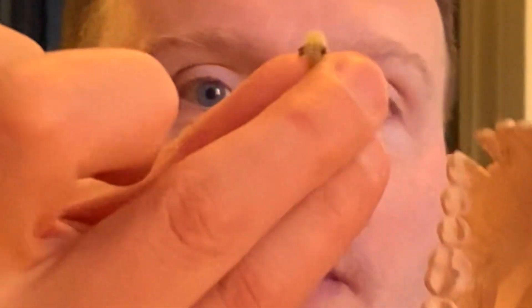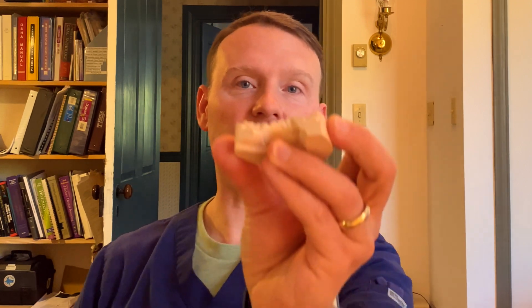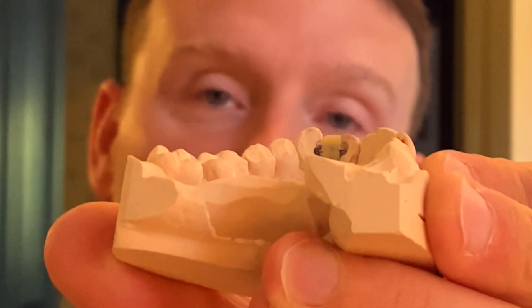A monodont bridge is very similar to a Maryland bridge, which I will be creating a video for in the future. There are a number of reasons why you should or could use one. As you can see, it's kind of like a plastic tooth or resin tooth with two little tiny metal wings. It goes into that space. The teeth are prepared from the tongue side, the lingual side. We insert it so it fits into grooves that are prepared into those adjacent teeth, and then we use composite resin material to cement it in place.